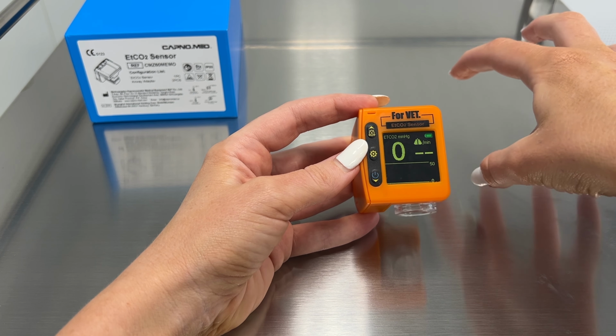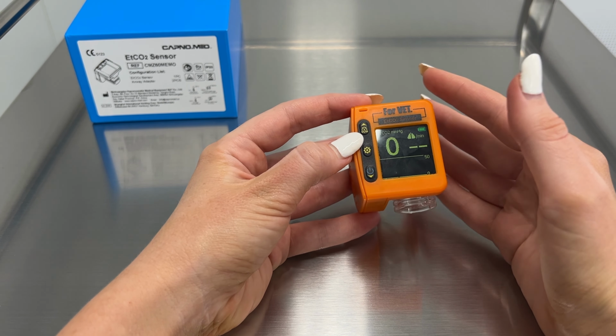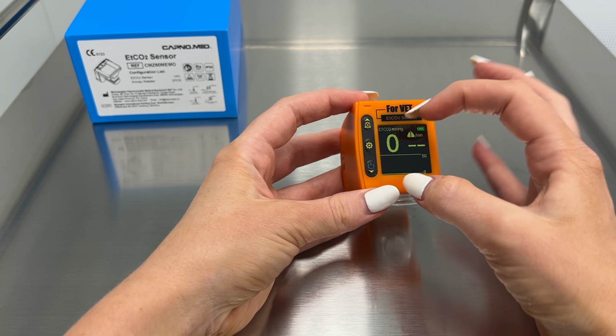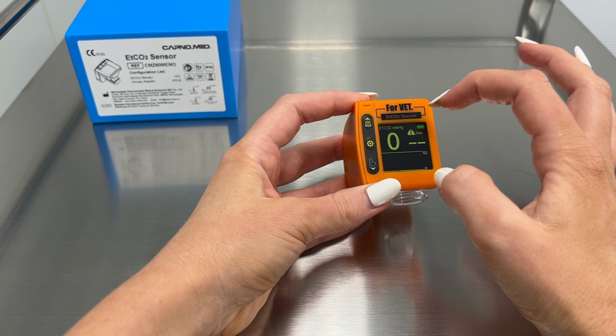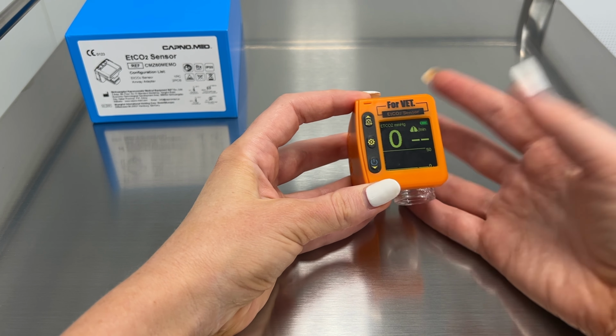Don't just kind of set it up and attach it to your patient and then think that it's going to go beeping, alarming at you when you're not looking. Please monitor this screen continuously. When you are doing your manual stethoscope measurements, make sure you are checking this screen. If anything looks like the parameters are out of whack, please adjust accordingly.